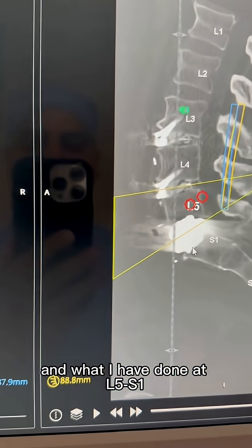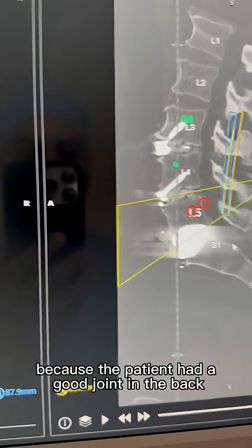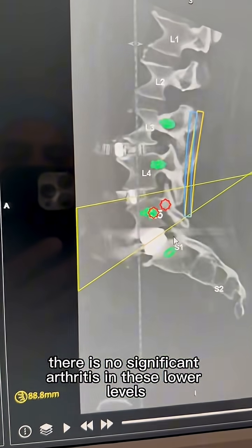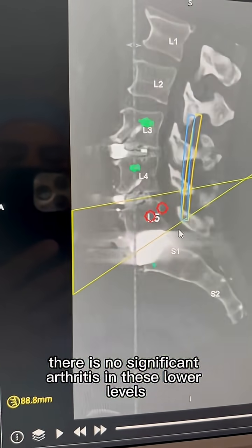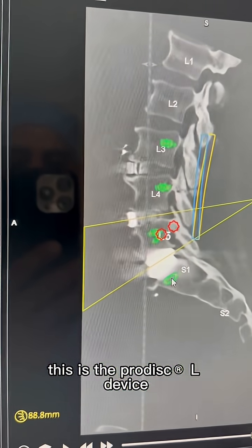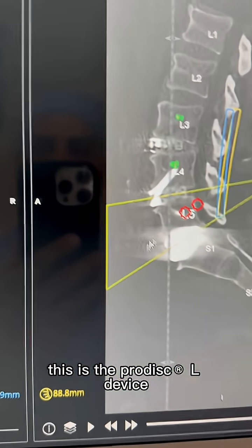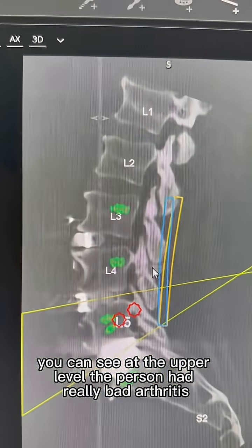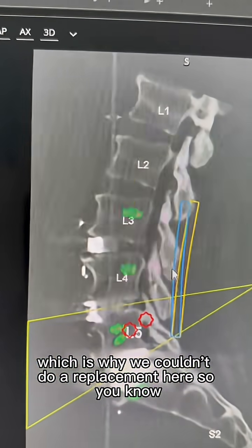At L5-S1, because the patient had good joints in the back with no significant arthritis at these lower levels, I performed a disc replacement surgery. This is the ProDisc L device. You can see at the upper level the patient had really bad arthritis, which is why we couldn't do a replacement there.